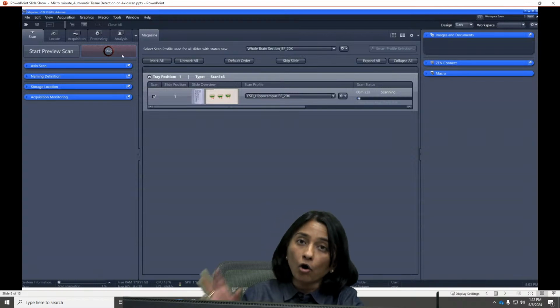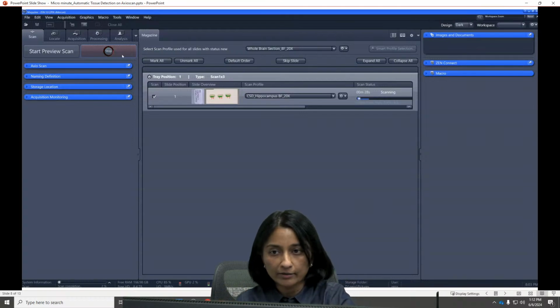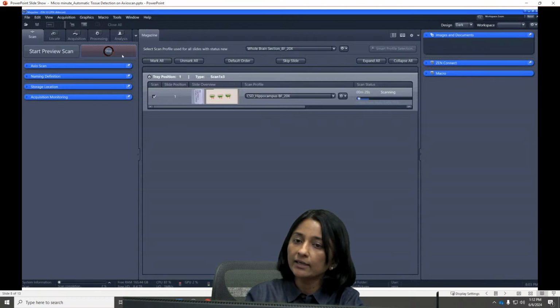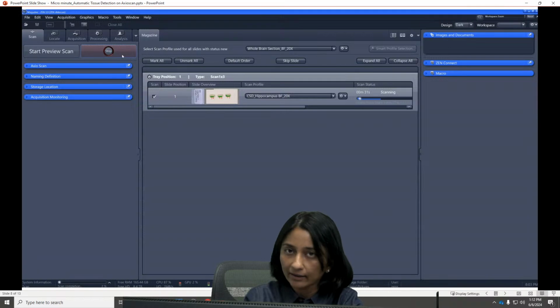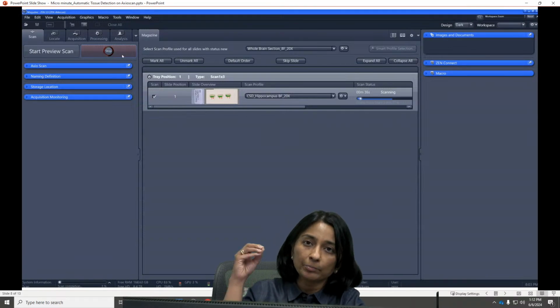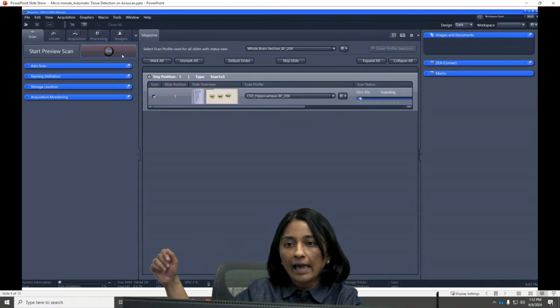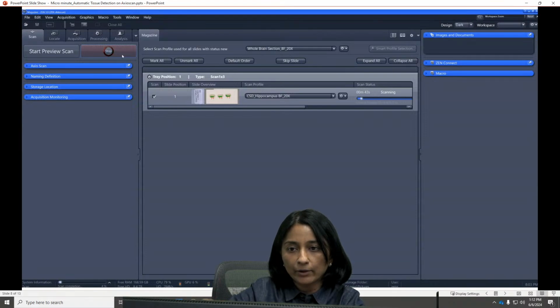That was done on the preview image that was generated with the preview camera, right? So I am not spending any additional time in scanning the slide with an additional objective. This is essentially the preview scan that you get from your preview camera. And so it detected the hippocampus, and it named them 1, 2, 3, 4, 5, 6, all the 6 regions.